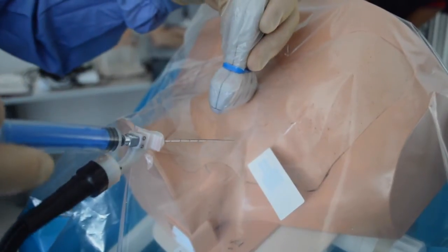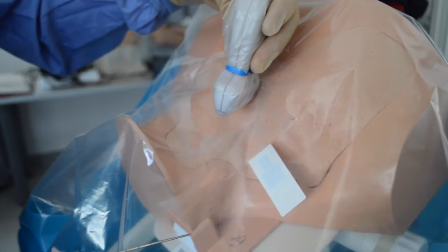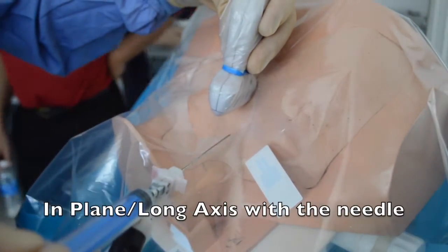For the oblique view, you are crosswise to the blood vessels, but in-plane or long axis with the needle.